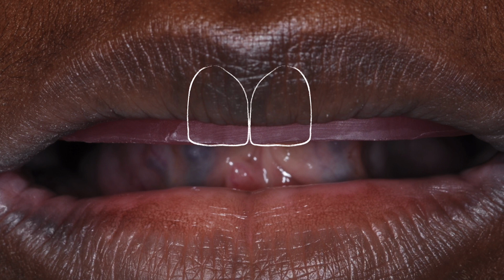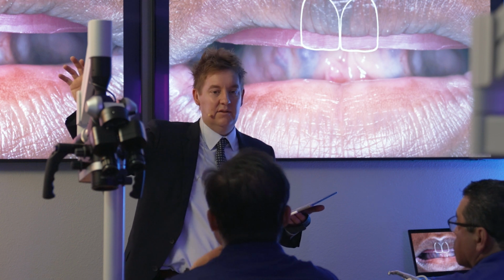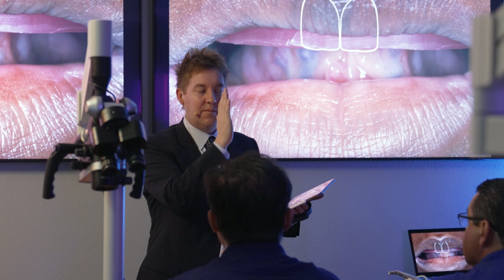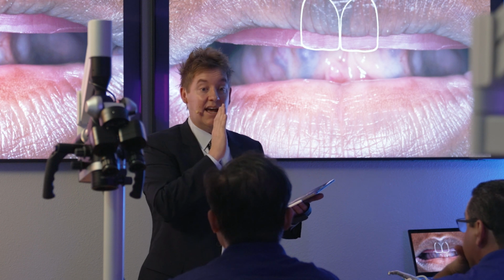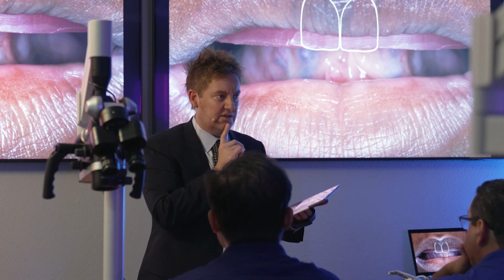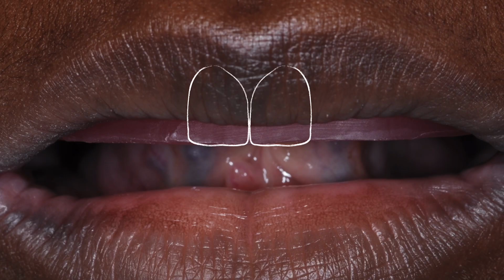How do we care about how the maxillary midline lines up with the mandibular? We don't at all. I can't tell you how many times we get cases because we have about 30 dentists that we do all their porcelain work for, and they'll be compromised in a facial midline. So we want the two centrals on the smile to be in the middle of the face and not canted. We don't care if they line up, but they always want us to move it one way or another to line it up with the mandibular central incisors contact point, which we never would want to do, right? We just want to make sure that they're not tilted to the left or right.